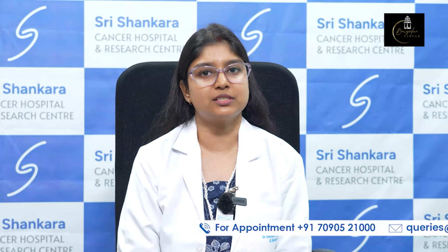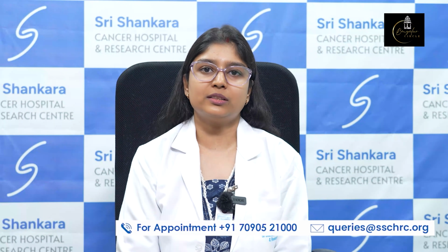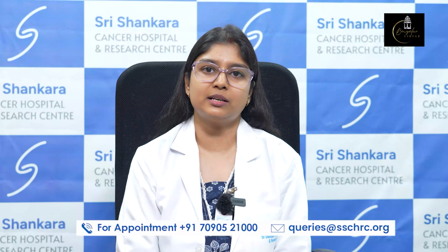Once the patient is advised a PET CT scan, the patient will take an appointment from our department, and after the appointment, the patient will be given an instruction list, which I also discussed right now. The patient has to follow all the instructions. On the day of the appointment, the patient has to come to our department.